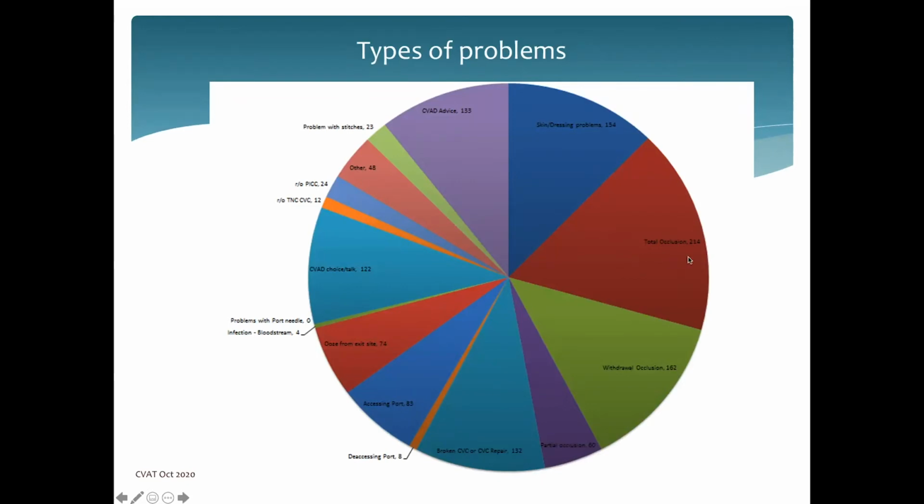Okay, we talked about catheter size. We talked about, if a child has a 3 French catheter, okay, that's a 1 millimeter internal diameter. So from a nursing medical point of view, trying to get blood from the line means that occlusions are higher risk. It will also lead us into one of my future wishes, is that actually we need to have more time and more ability to actually offer training and education for the wards, so in the aim that we can hopefully reduce all the occlusion problems.